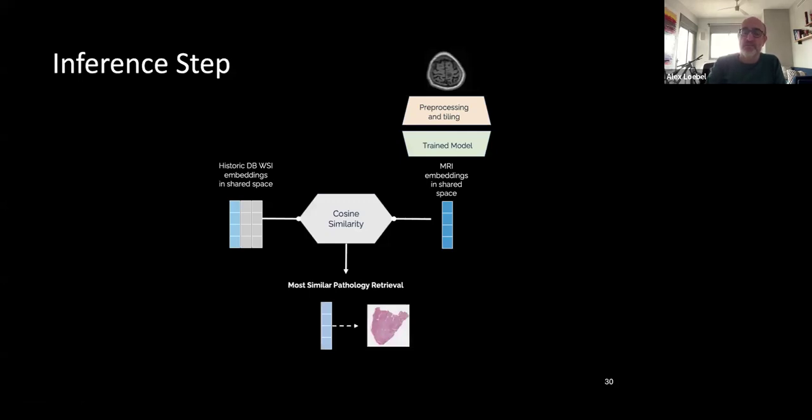It is called learning with privileged information. This is like a technical term because it means that during the training, the model has the privileged information of the pathology, but not during the inference, or not when we have new patients. But the idea is that by having for the new patients only the radiology, you can still get good enough results and diagnosis already at the stage of radiology to maybe begin even treatment, that's the plan at least, already early enough at the stage of the radiology.